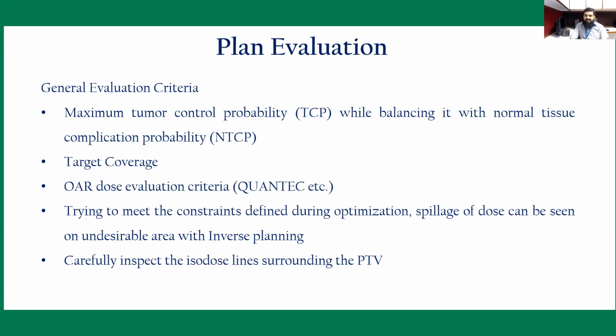When you are happy with your plans and the coverage, then you have to evaluate your plans. The general criteria is the same, which we are always hearing about, the TCP and the NTCP. Although we are not using the same criteria by following the prescribing and recording of ICRU 83, this is the general evaluation.